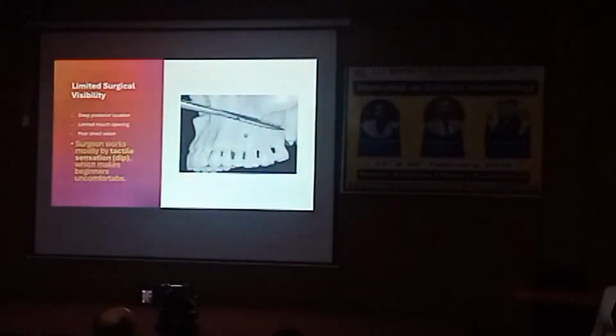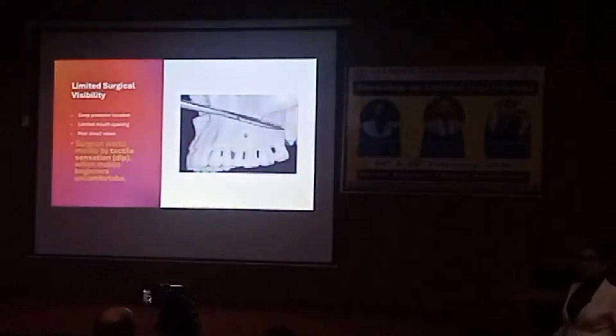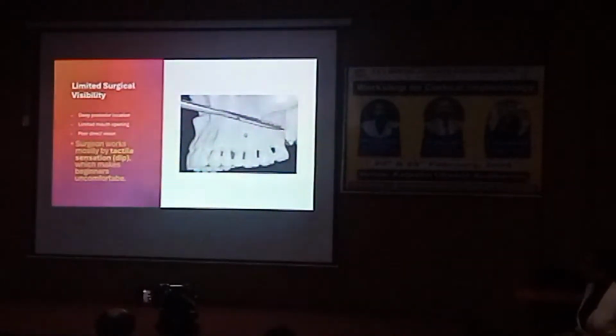It needs a lot of skill, or maybe as you grow older and older, you may not be able to excel at the technique. So we omit it. We learn tilted implants and increase the AP spread a little with tilted implants and never try for pterygoid implants. But for pterygoid, the surgeon works with tactile sense, and that tactile sense is a dip.